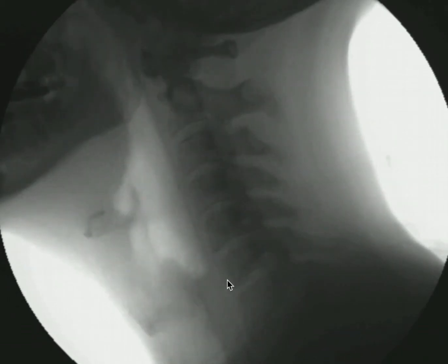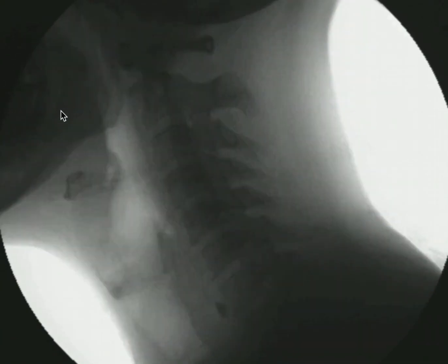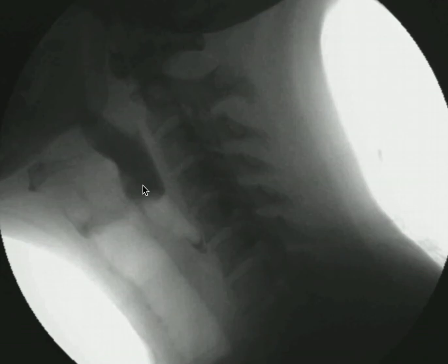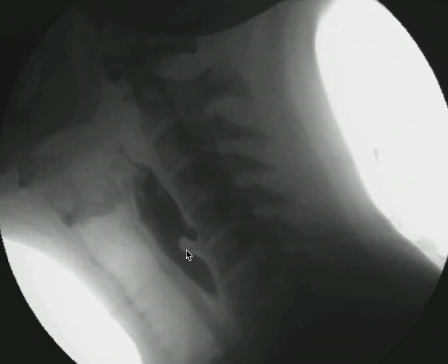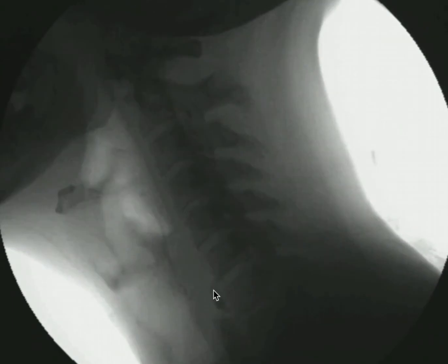So we'll repeat this process and have the patient swallow again. They'll get an additional bolus of barium right here, which will now continue inferiorly. And again, go right here over the cricopharyngeus muscle and get stuck at this point and go down the narrow neck right here in this Zenker diverticulum.